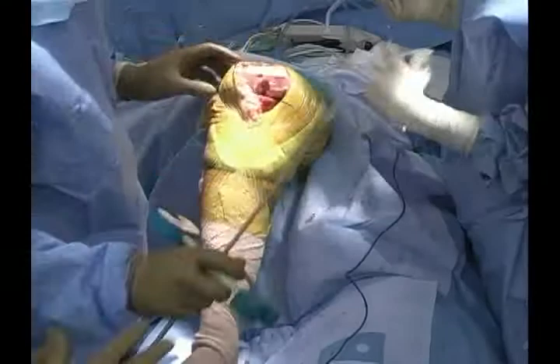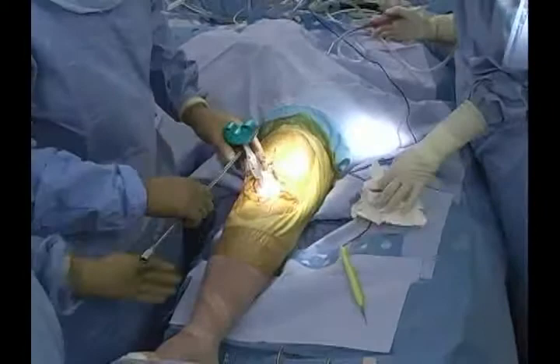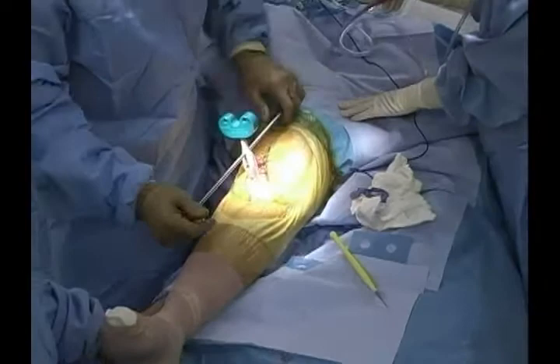We can then do the same in extension — please hold the heel up. Our extension space is extremely well-balanced, with less than a millimeter of toggle on each plane in extension.